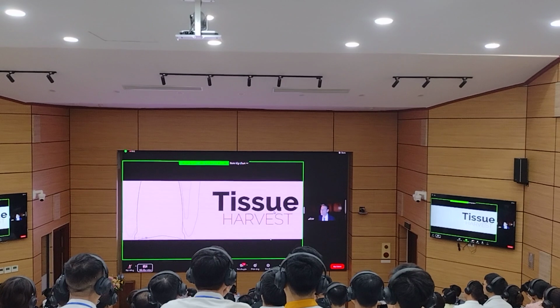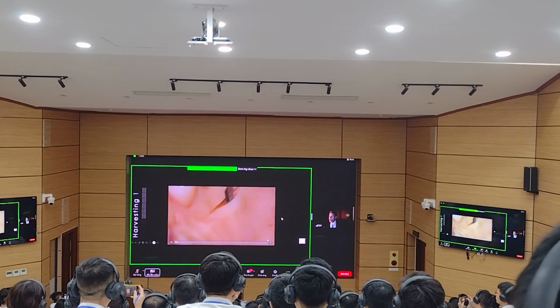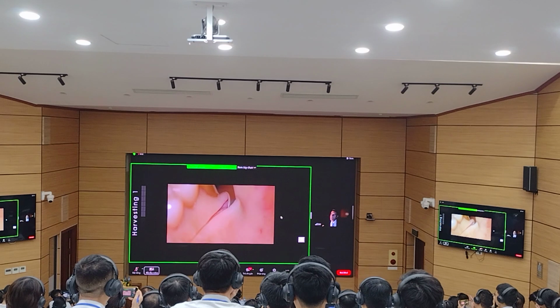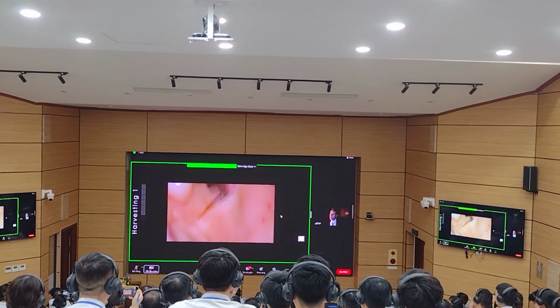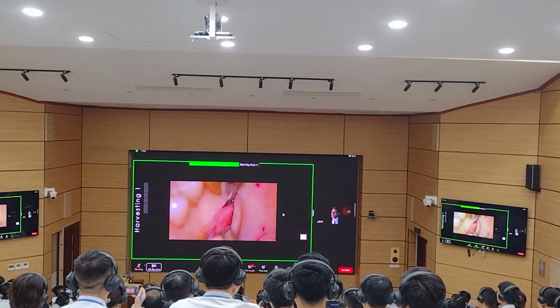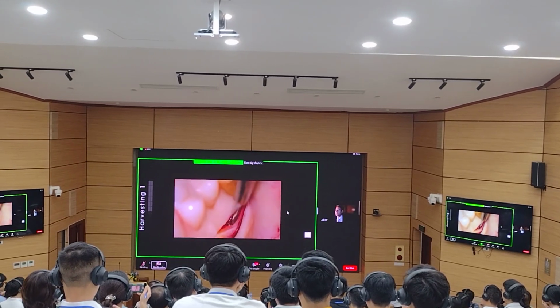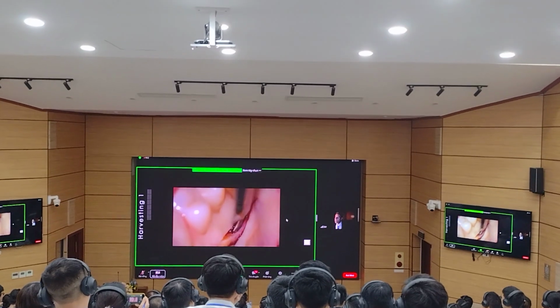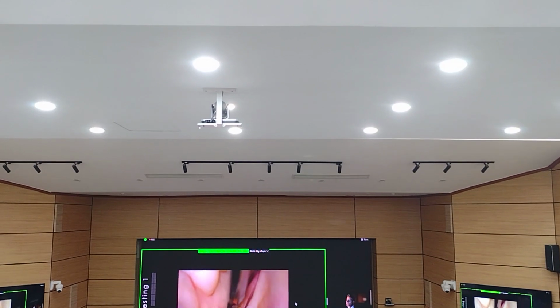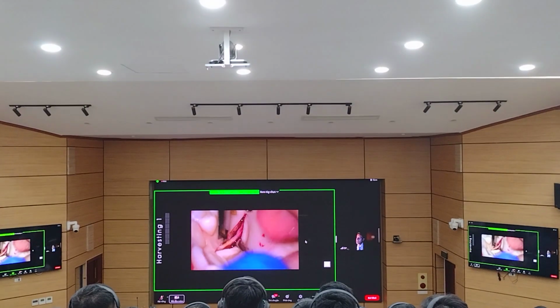When we look at the harvesting of tissue, when we're working with magnification, it becomes a lot easier to perform these procedures because we can see what type of tissue we are removing. We can differentiate between adipose tissue and good quality connective tissue. We have a little bit more control as far as what is the amount of tissue that we're going to remove when we're going to utilize a subepithelial connective tissue approach. That is what we're going to be seeing when we're working with high magnification and appropriate illumination. It becomes very, very useful for us to be able to do different types of incisions that are customary of this type of procedure.